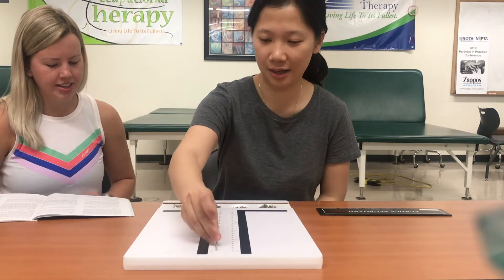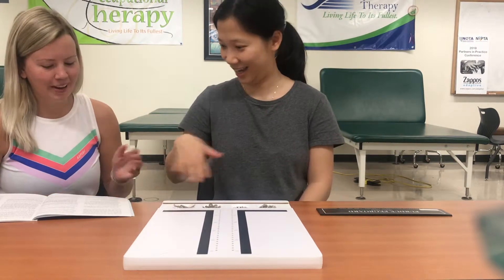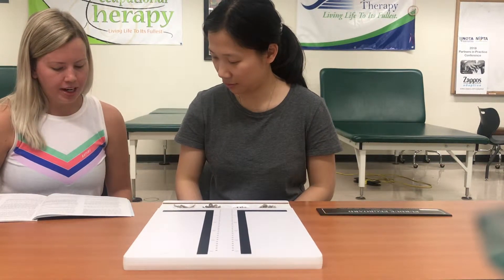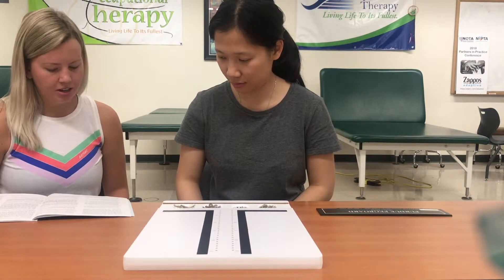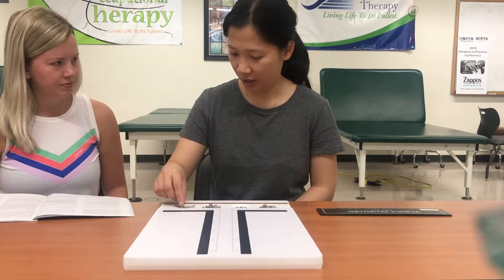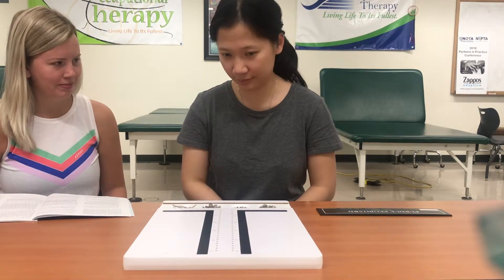The subject practices inserting pins. After practice, the examiner instructs: take out the practice pins and put them back. When I say begin, place as many pins as you can in the right-handed row. Starting with the top hole, work as rapidly as you can until I say stop. Are you ready? Begin.